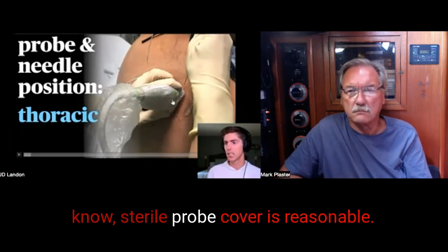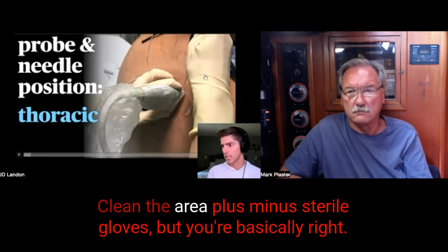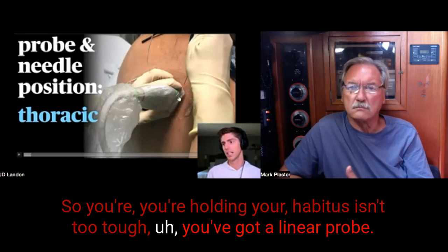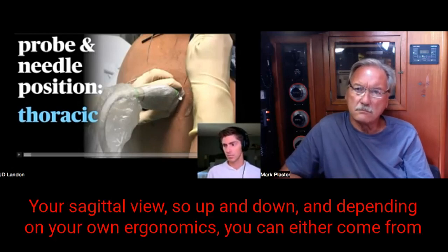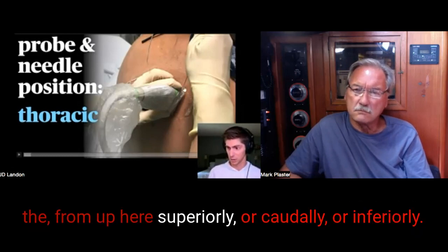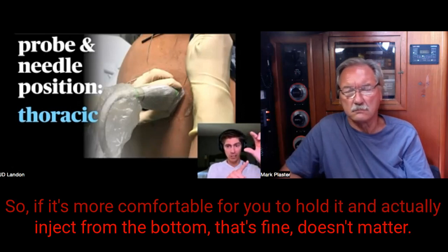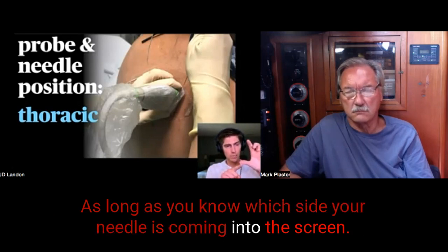A sterile probe cover is reasonable. Clean the area, plus or minus sterile gloves. But you're basically right. So you're holding, hopefully, if the body habitus isn't too tough, a linear probe in your sagittal view, so up and down, and depending on your own ergonomics, you can either come from up here superiorly or caudally, or inferiorly. If it's more comfortable for you to hold it and actually inject from the bottom, that's fine. Doesn't matter, as long as you know which side your needle is coming into the screen.